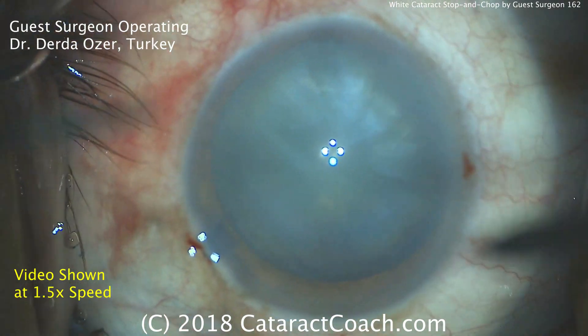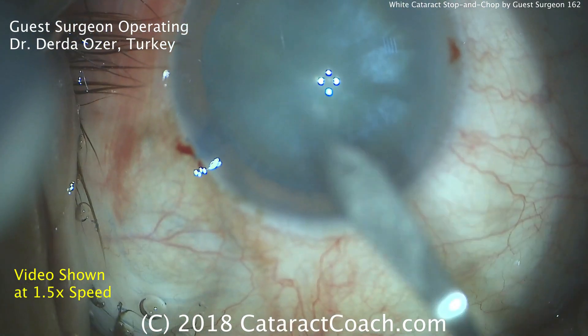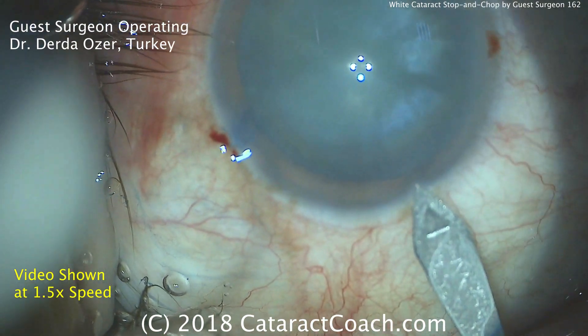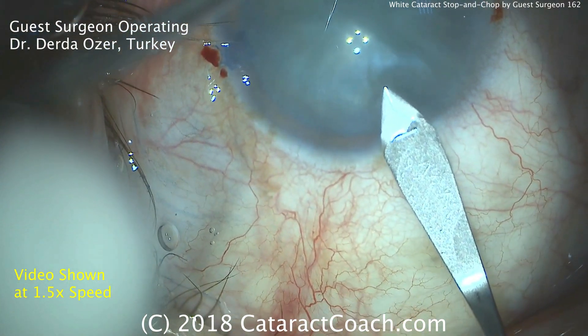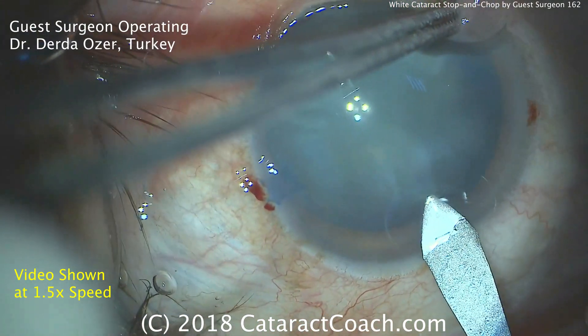CataractCoach.com. It's a white cataract; blue dye has been instilled. Here comes the phaco incision — let's watch carefully. It's a nice tunnel length, and there's the AC entry. Looks like a two or three plane incision.